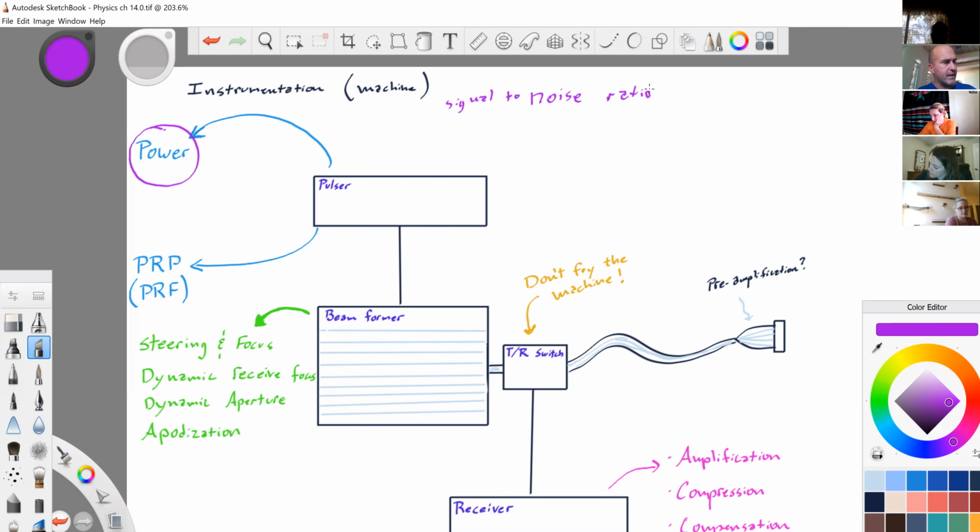We could skip thermal index and mechanical index, because we talked about that in chapter 24. It's adjustable, yes. You have direct control of the power button. It does have a preset, but you can always turn it down or perhaps even up. Lower power means lower bioeffects; higher power means more chance for higher bioeffects.